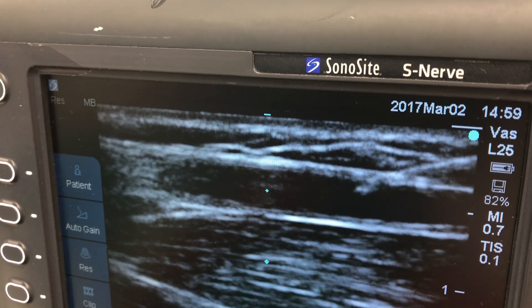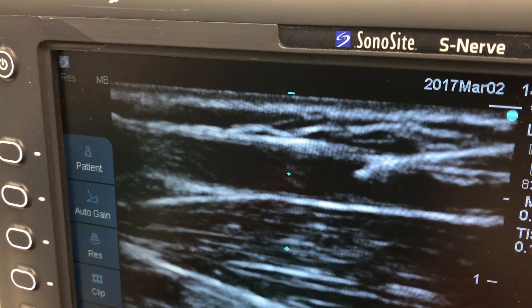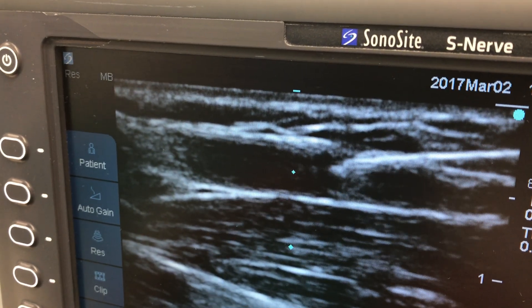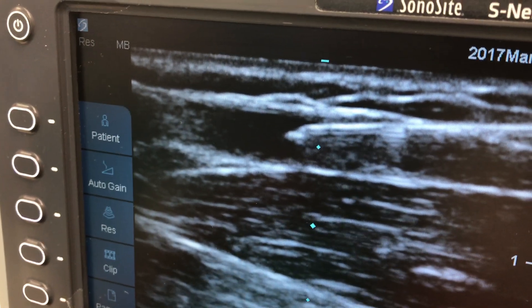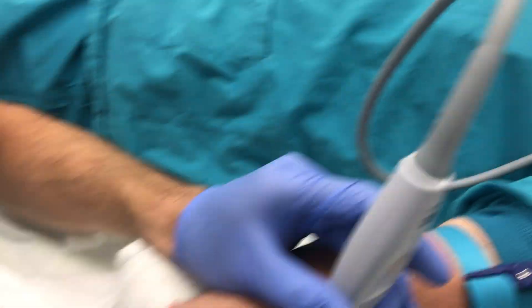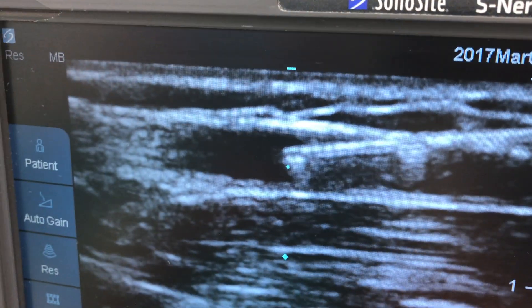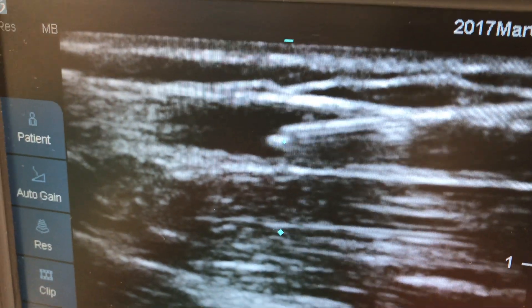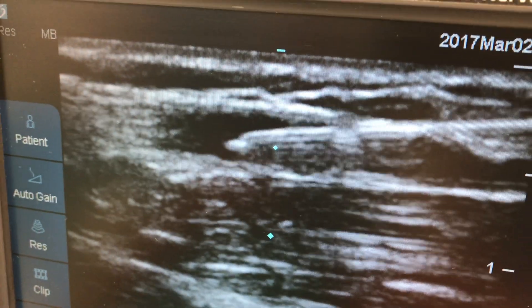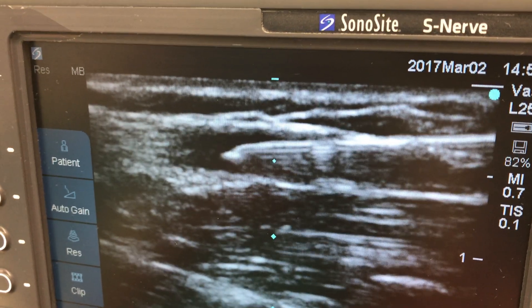Now I'm going to advance, watching the screen, flattening out my angle, trying to make sure I'm keeping a sharp image of the vessel and a sharp image of the needle on the same screen. You can see how much clearer the image of the needle became — when the needle is inside blood rather than inside tissue, the definition becomes much sharper. So I'm confident it's in. I'm advancing the whole thing together a little bit of the way, then I just advance the cannula.